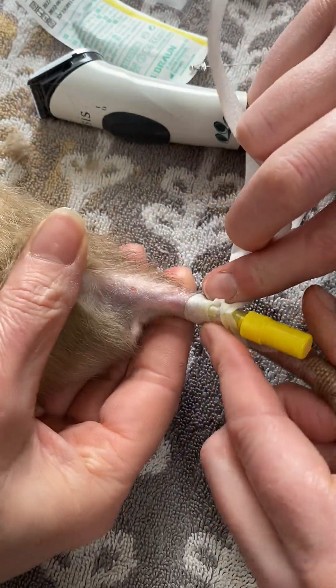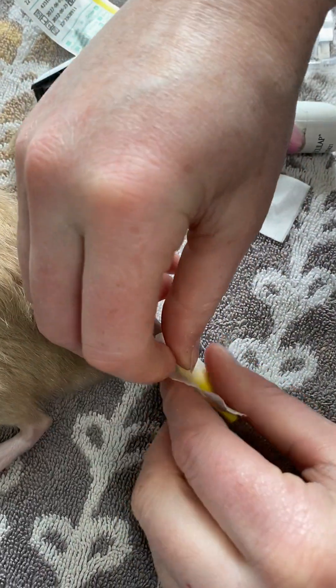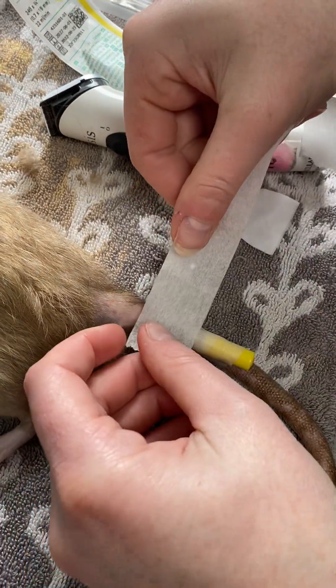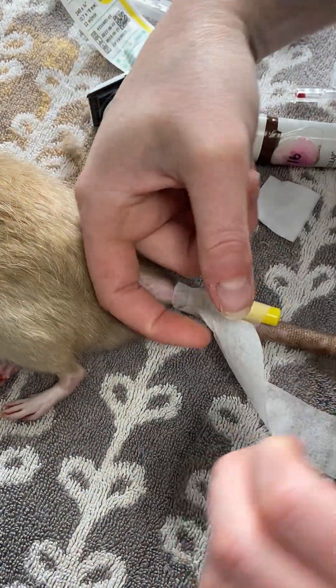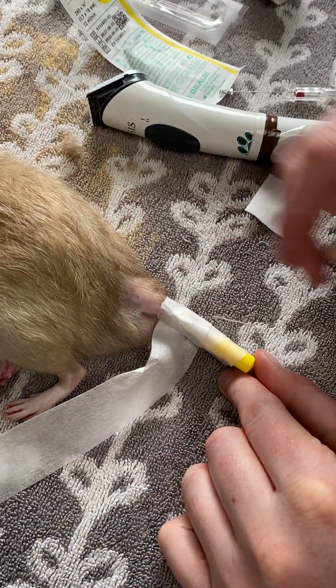This means that the individual can have intravenous medications during the anaesthetic, and we're also going to be able to replace any fluid deficits. If they're hospitalized, normally they tend to leave them alone if they're feeling particularly poorly, but we predominantly use these for our anaesthetized patients so we can make sure that they have fluid resuscitation throughout the anaesthetic and that we can give medications in an appropriate way.